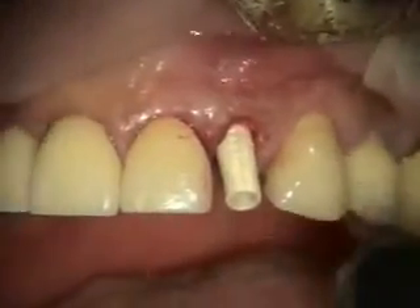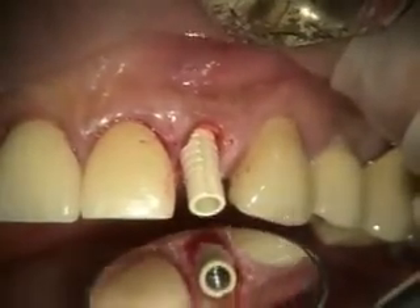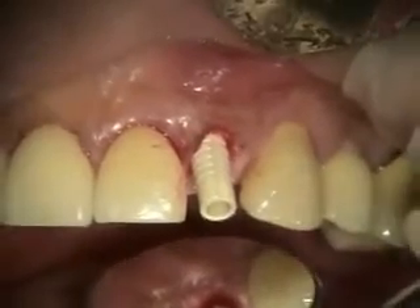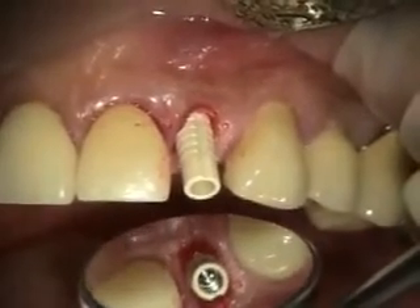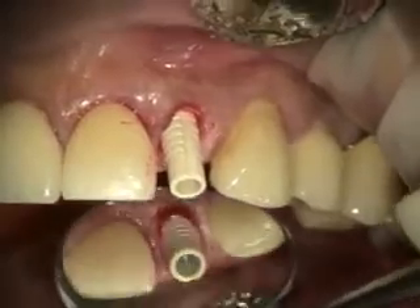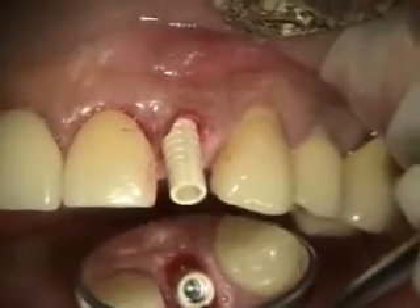We've got our provisional abutment in place and I'm just going to look at it and decide — do I need to shorten it, where do I need to prep it? You can prep it in the mouth, but it actually goes faster just putting it on an analog and knowing where you want to end up. So I'm going to be trimming the lingual, trimming the facial, and trimming the height of it.